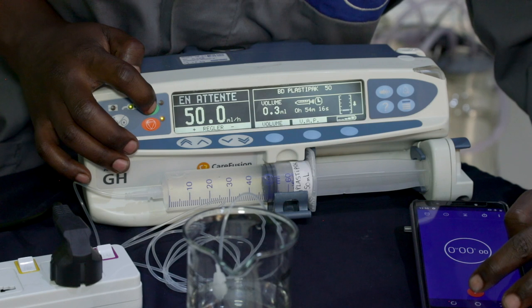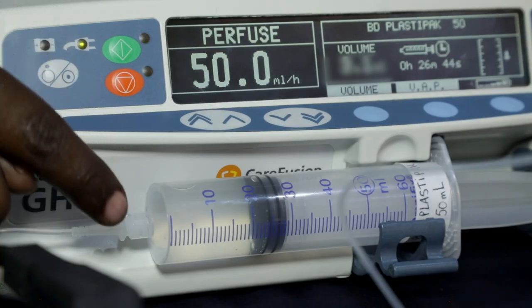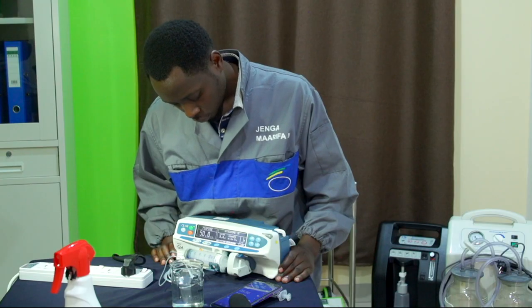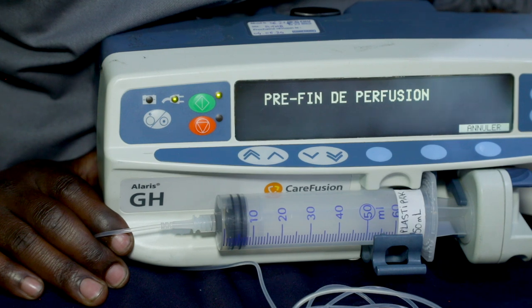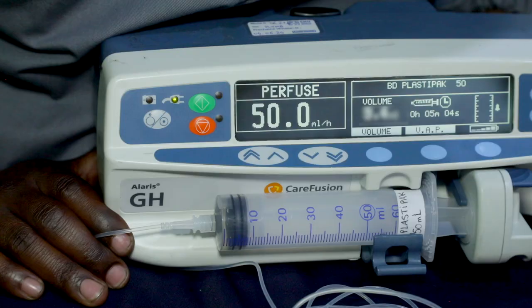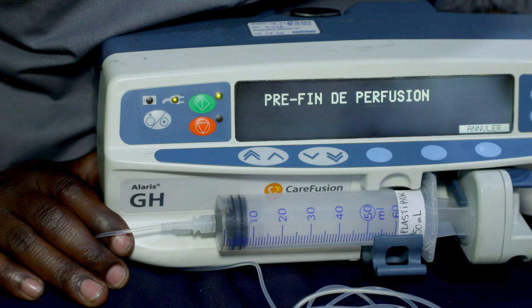On lance alors la perfusion et on démarre le chronomètre en même temps. On vérifie qu'au bout de 30 minutes, la graduation sur la seringue soit précisément 25 ml. On va vérifier qu'aux alentours de 55 à 56 minutes, une pré-alarme sonore et visuelle de fin de perfusion indique qu'il reste moins de 5 ml à perfuser. On va vérifier qu'au bout d'une heure précisément, la totalité de l'eau est perfusée, c'est-à-dire que la seringue est vide, et que l'alarme de fin de perfusion retentit.